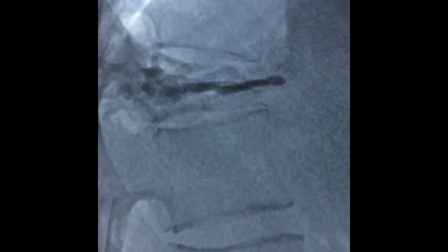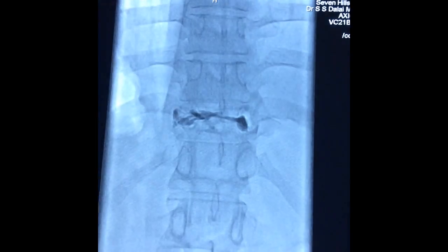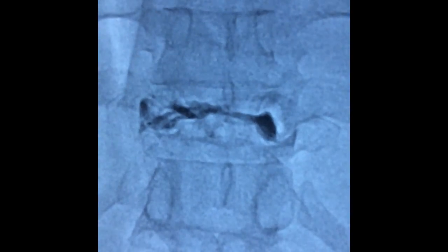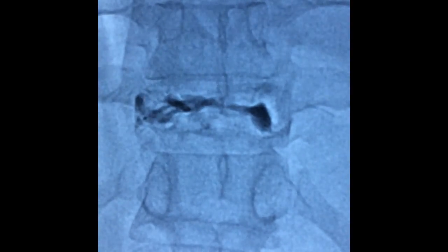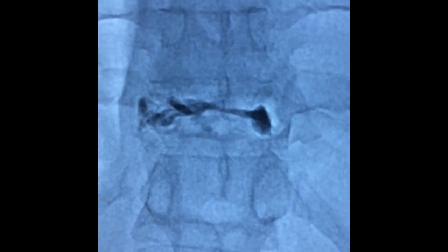With a good close-up view, we can see it very nicely — the cement has occupied the entire vertebra. Looking at the AP view, it looks absolutely fantastic with a good, even spread of cement throughout the entire vertebra.